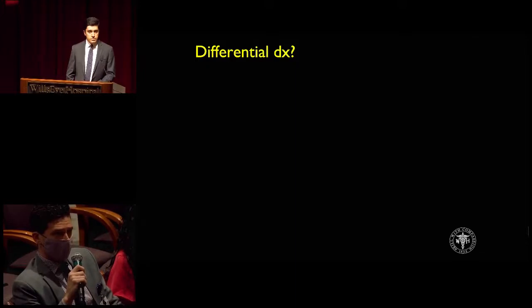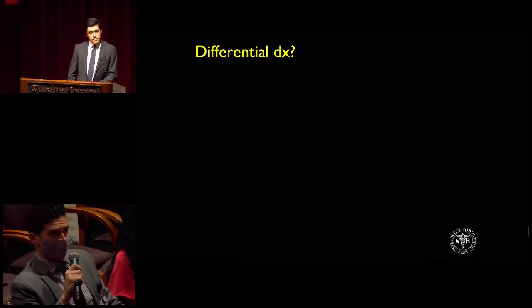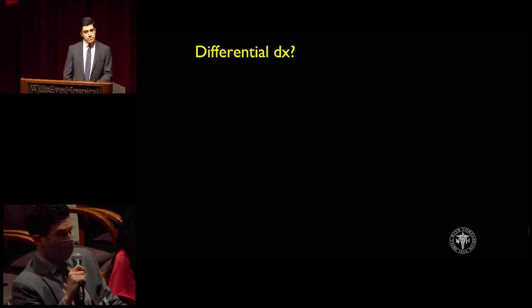Other things, probably less likely, but a chronic CSR picture could cause some outer retinal abnormalities, marked atrophy, especially if it's been ongoing for a long time. However, it sounds like this was relatively acute vision loss, so it would probably be unlikely. The area of retinal whitening could suggest some sort of an ischemic process. Didn't look like a classic CRAO picture, but I would also want to know about history of hypertension, diabetes, smoking, other medical comorbidities. And then, you could also consider other inflammatory causes, like white dot syndromes, where there can be loss of outer retinal layers.